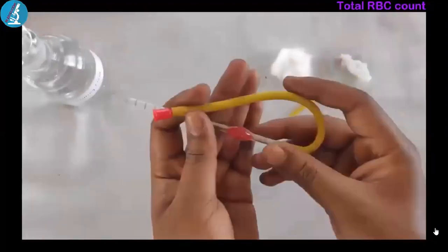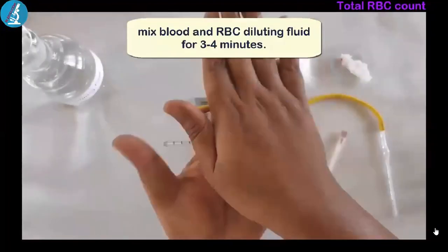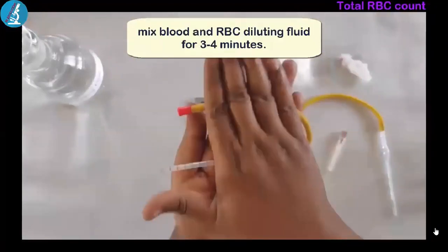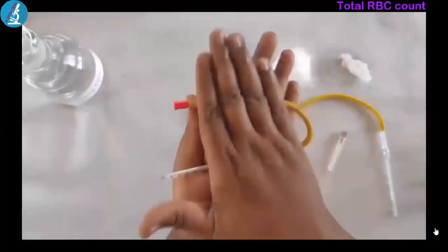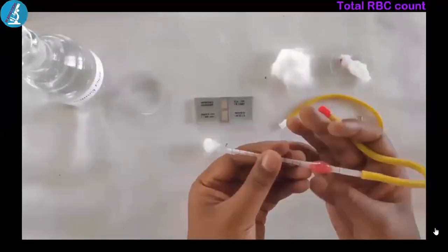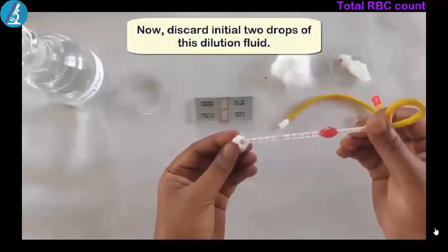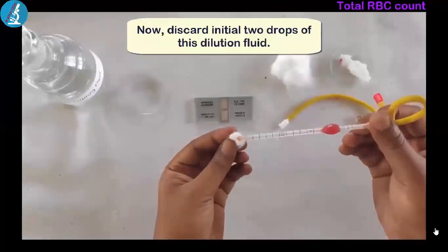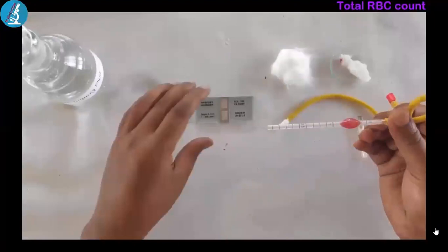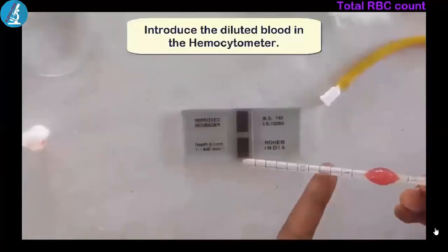When you do that, you mix blood and red blood cell counting fluid gently for about 3 to 5 minutes. Then you discard the initial 2 drops of this dilution fluid so that you have the normal proportion where you have well diluted red blood cells as you are charging the Neubauer chamber.